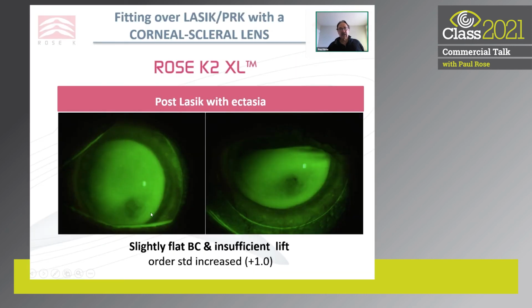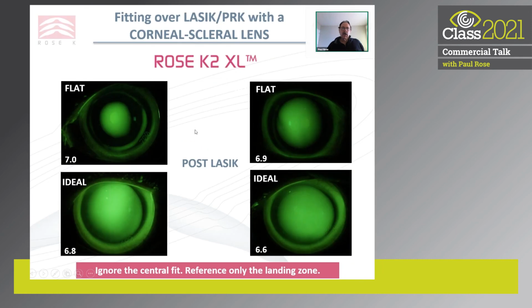Here's a post-LASIK ectasia that's a little bit too flat. I would want to increase and steepen that base curve a little bit, and also loosen up the periphery with a +1 edge lift. It's interesting to note what happens when you steepen the base curve with XL.